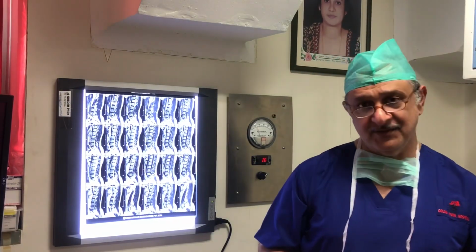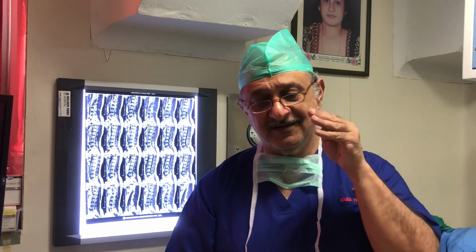What is a high intensity zone? A high intensity zone is basically a tear of the annulus. When the lamellated fibers of the annulus tear, discal material protrudes within that tear. The nucleus tries to enter into the annulus. Part of it undergoes mucoid degeneration, and this gives rise to a high intensity signal in the posterior part of the disc.